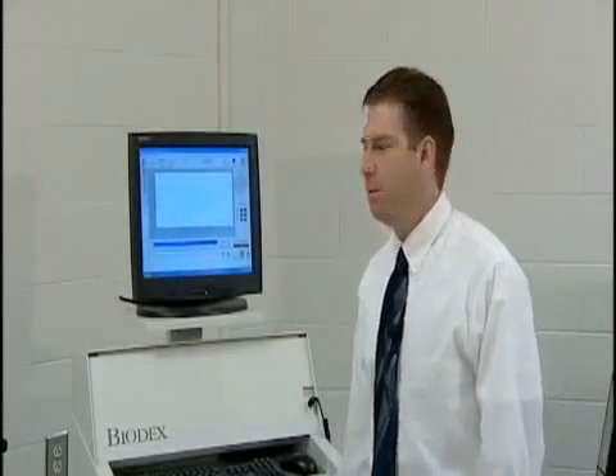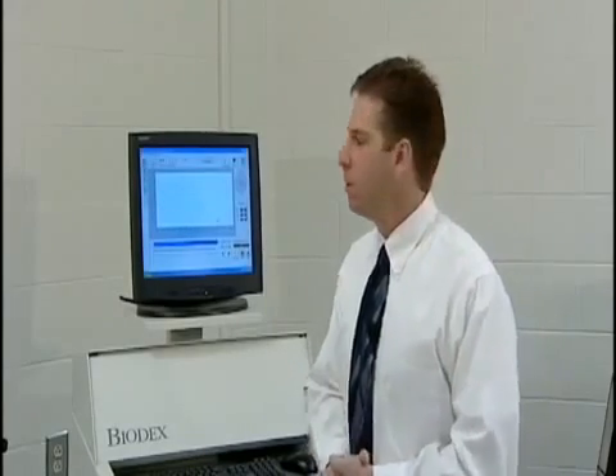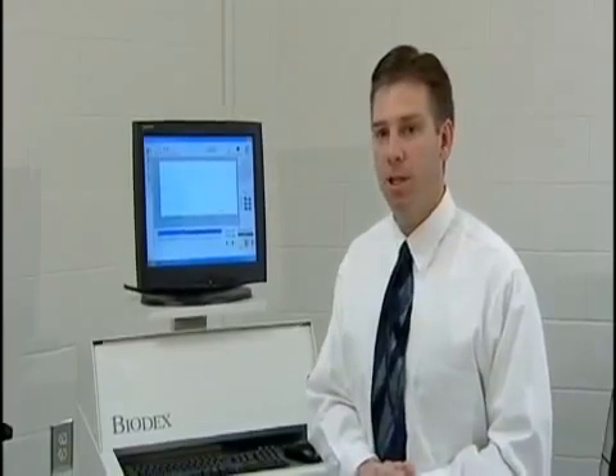Today's laboratory activity will involve the Biodex isokinetics muscle testing system. We've used this system for teaching basic muscle function concepts in our exercise physiology and exercise testing laboratories. We've also used this to test some of our Coastal Carolina University athletes, as well as for rehabilitation purposes.